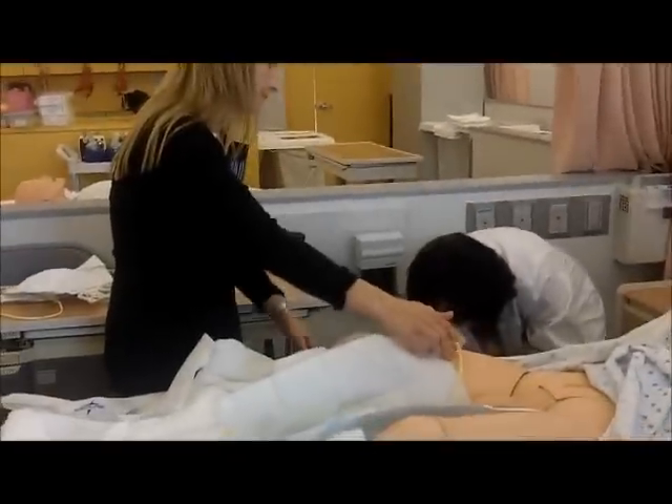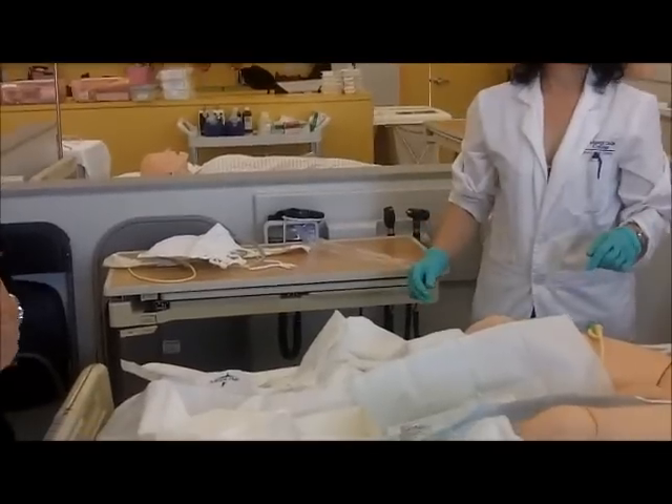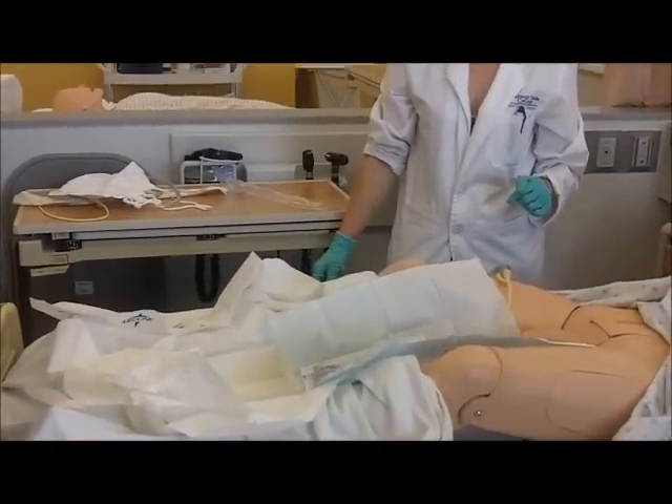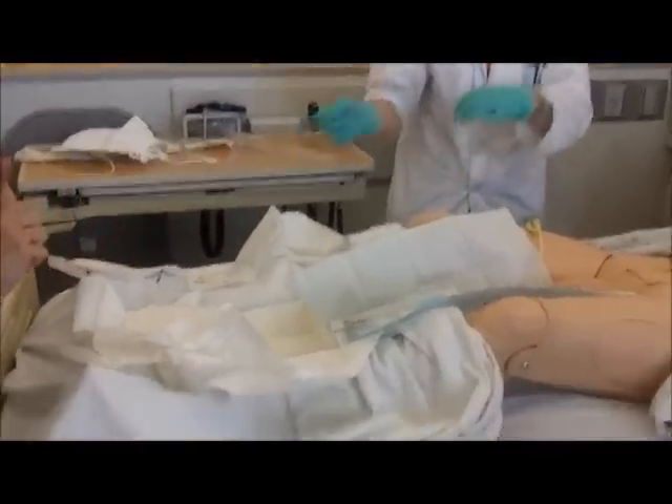Do you wash off the iodine? No. It just stays. Yes, okay. That's it. You want to cover the patient. You want to put your supplies away. Bye, okay guys, bye.